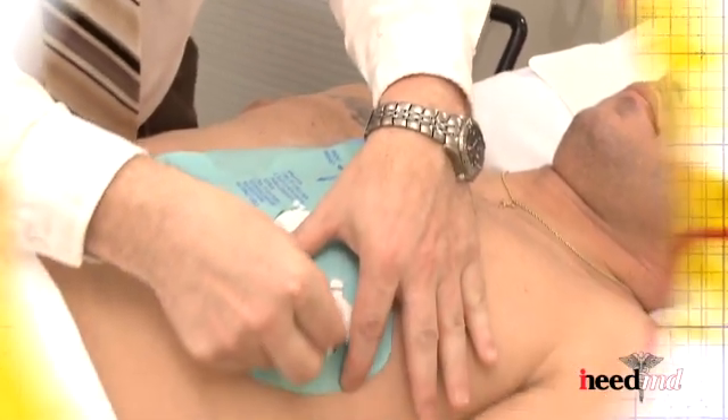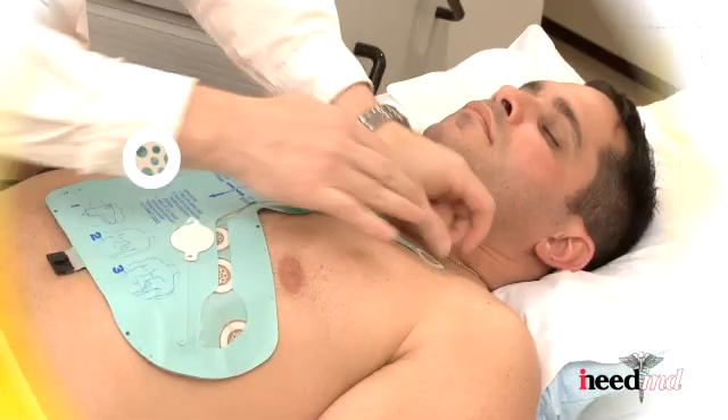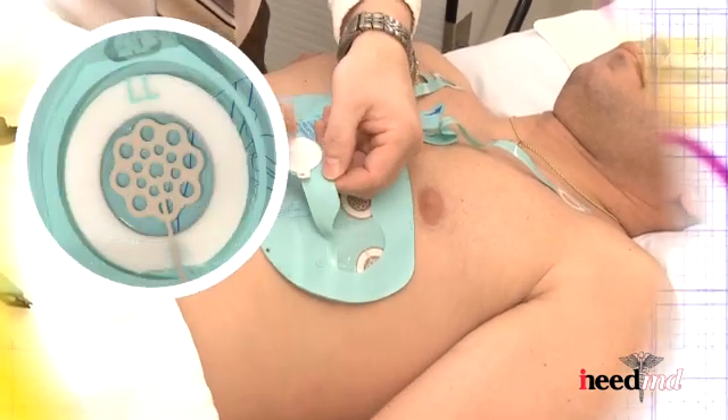Repeat this process for the extendable electrode labeled LA and place it below the left collarbone. Repeat the process for the extendable electrode labeled LL and fully extend it to the lower left rib cage.